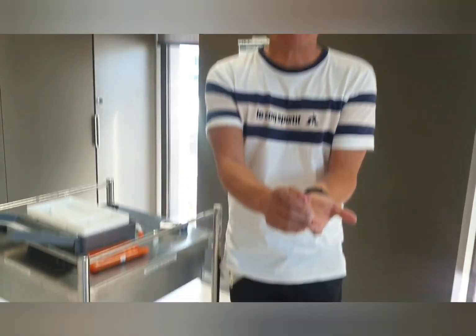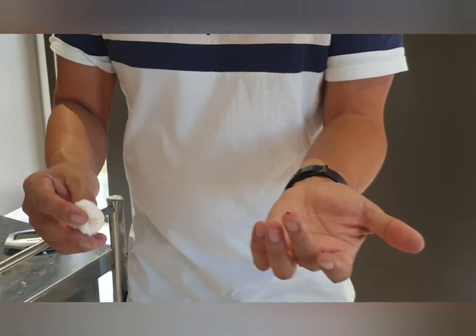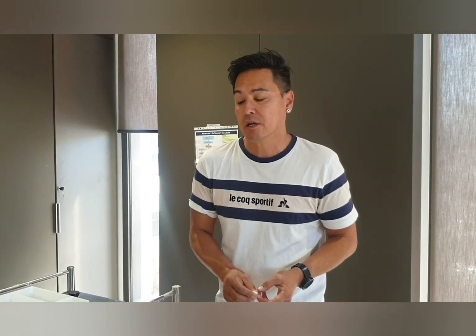One quick addition: it's been five minutes since I pricked my finger. If you didn't get a proper reading, before you expose your patient to another needle, try grabbing their finger and squeezing it again. I think I might have some coagulopathy or something because I can go back in an hour and still get a blood circle out of this. Just have a bit of a think about that — and thank you.